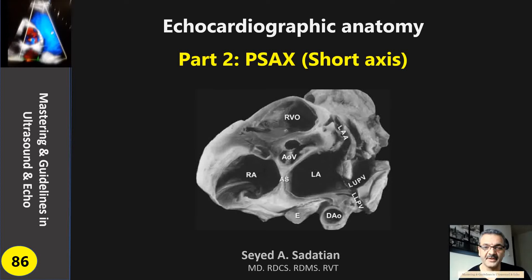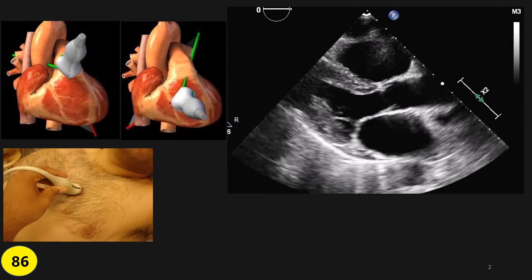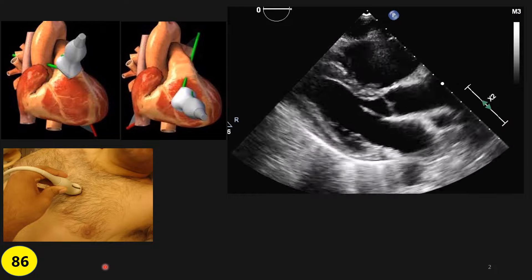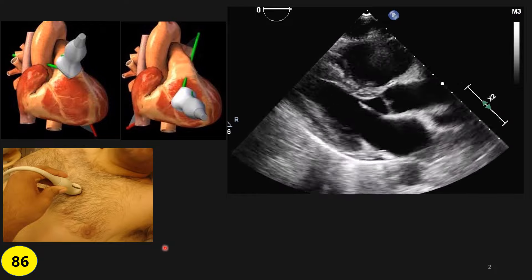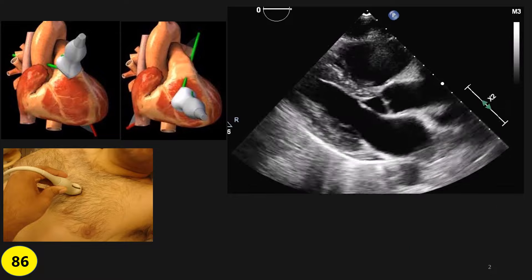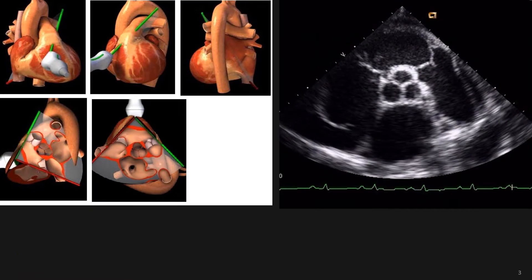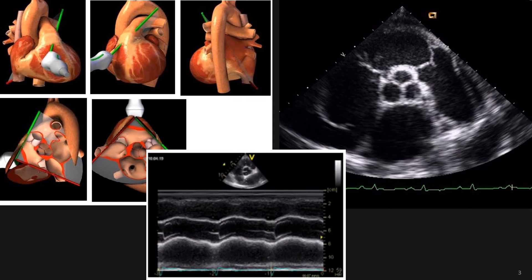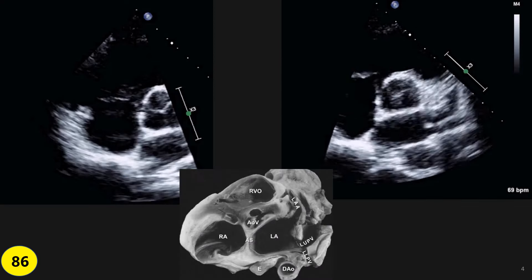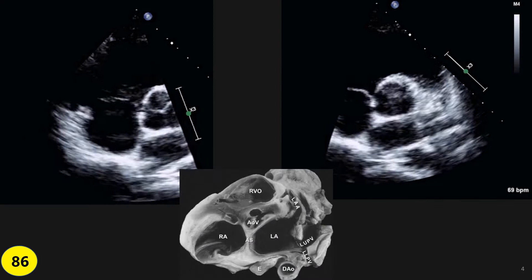Welcome to mastering guidelines in ultrasound and echo. In this presentation, I'm going to talk about parasternal short axis cross-sectional anatomy, detail of each view, how we can get those images, and what we have to consider in each of those views, as well as other modalities we use on the short axis.